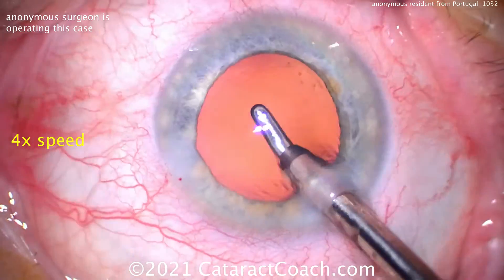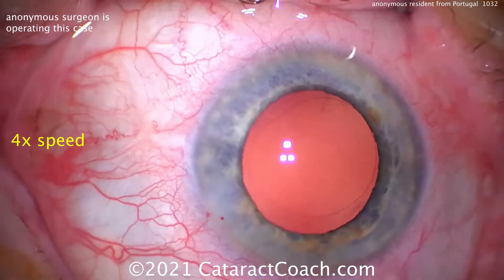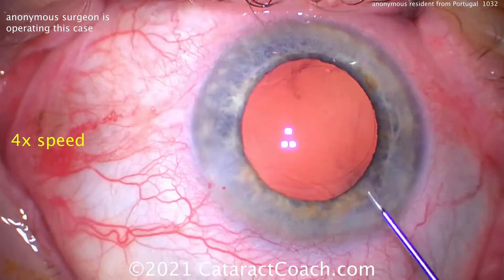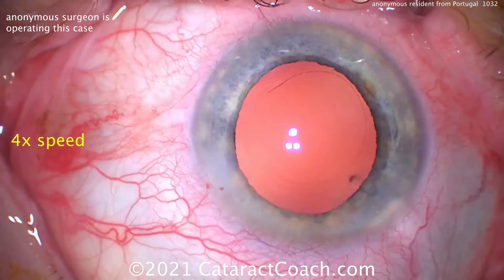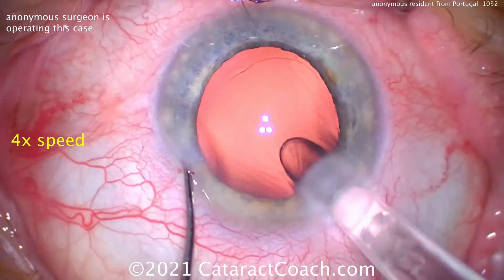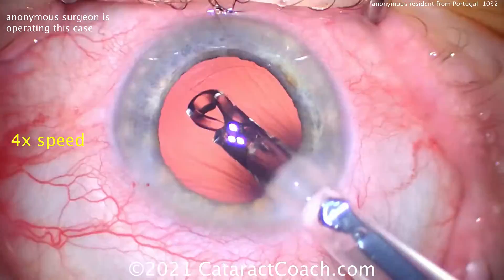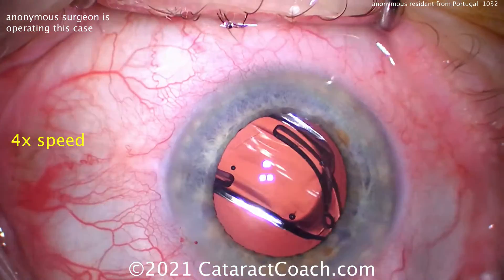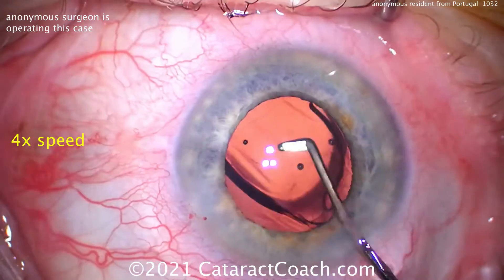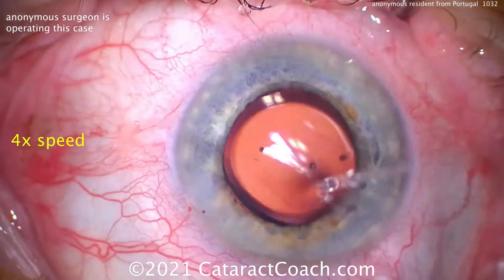Let's see what we're going to do for the lens choice. Here comes some viscoelastic filling up that capsular bag, and here comes the lens — looks like single-piece acrylic, hydrophobic acrylic. Looks good going in the bag. Maybe that AMO Johnson & Johnson Tecnis lens, monofocal.